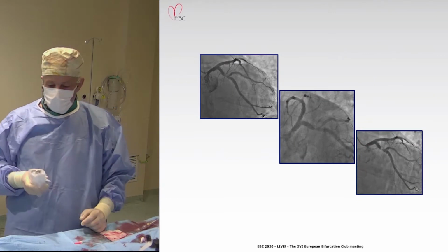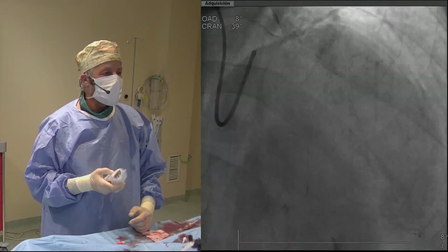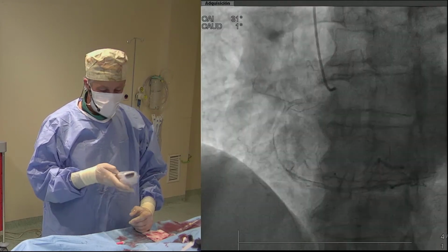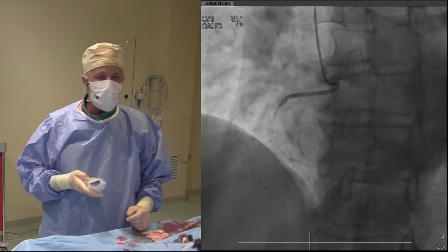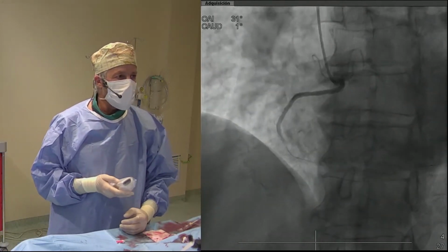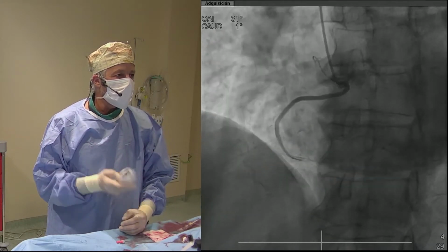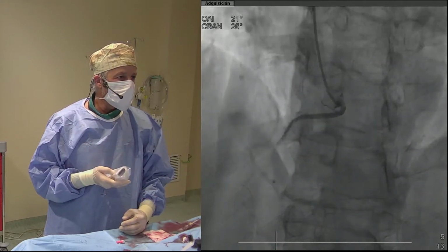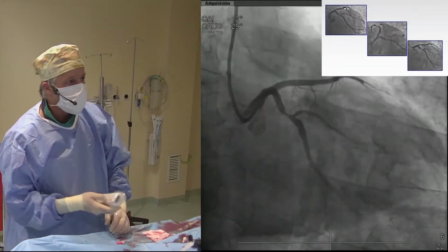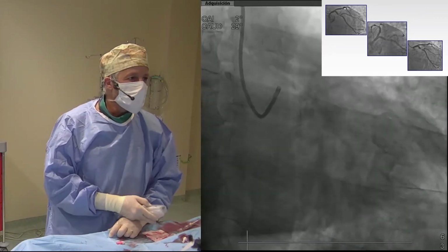This is the bifurcation, but I can show you other data because I have the angiography done today again. We did the diagnostic last week, and you can see in the slide the bifurcation in the circumflex that is really the culprit. But we have here the right coronary artery, which is normal. There is no stenosis in any place in the right. And we have here the angio for the circumflex. It's the same as you can see in the still frame in the slides.